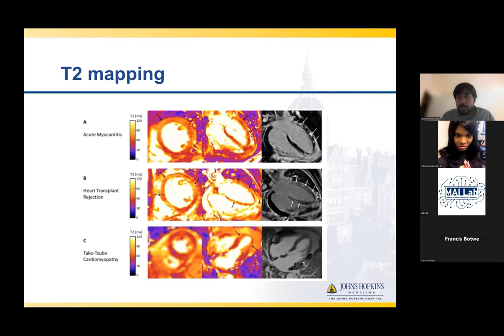Here is the visual depiction of T2 maps. Obviously, color-coded here with the kind of heat map. And you can see that there is edema in the anterior septum, anterior wall, lateral wall, and this is about basal to mid myocardium. Now these walls kind of look normalish. So you can appreciate that the lateral wall here on the four chamber looks like there is some edema here. The septum looks okay. And when you look at the LGE images, you can see that not so much in the septum, but on the lateral wall, you see some subepicardial scar. You see also some like rat bite kind of patchy subepicardial scars. And these put together will give you a diagnosis of acute myocarditis based on the modified Lake-Louise criteria.